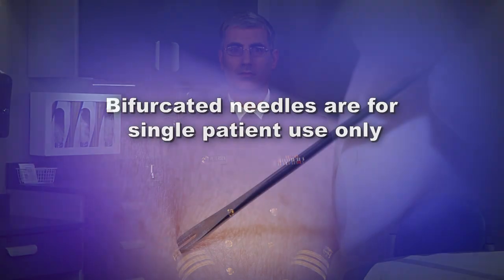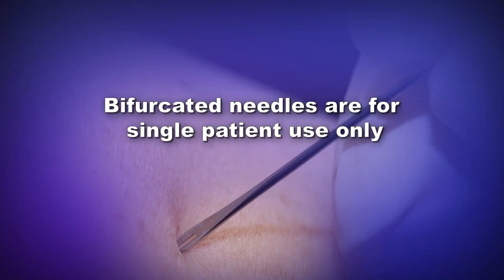The jabs should be vigorous enough so that a drop of blood appears at the vaccination site. Discard the needle in a biohazard sharps container. Remember, bifurcated needles are for single patient use only. Wipe off any excess droplets of vaccine and blood from the skin using a dry gauze pad and discard the pad in a biohazard container.